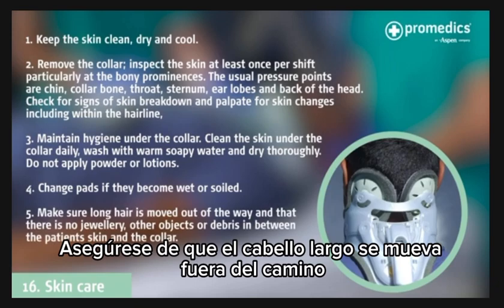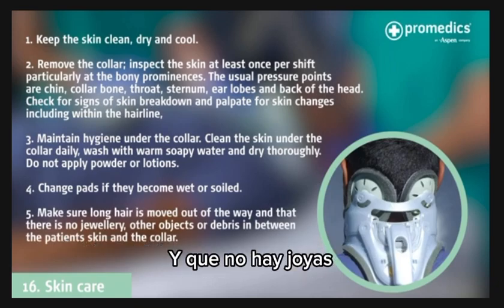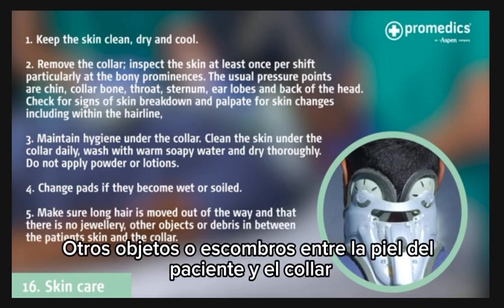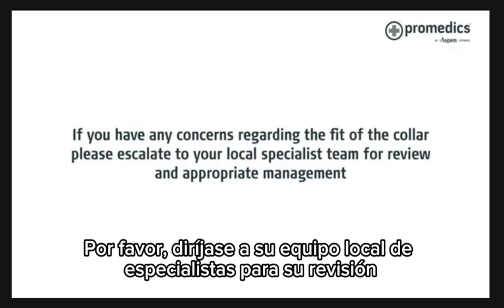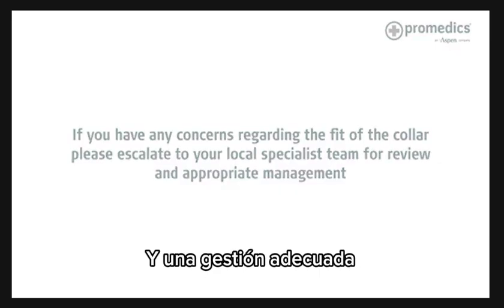Make sure long hair is moved out of the way and that there is no jewellery, other objects or debris in between the patient's skin and the collar. If you have any concerns regarding the fit of the collar, please escalate to your local specialist team for review and appropriate management.